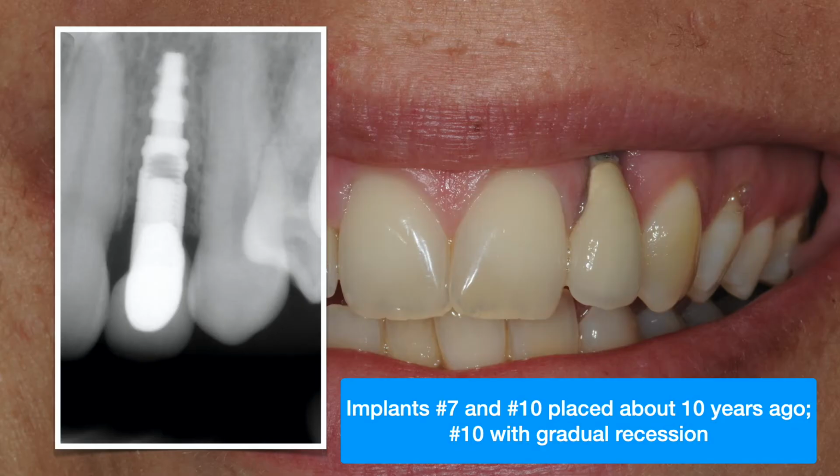The patient came to us with implants number 7 and 10 that were placed about 10 years ago. The number 10 site gradually developed some recession over the years. Her chief complaint was just poor aesthetics. She was very aware and conscious about the aesthetic issue with the recession.